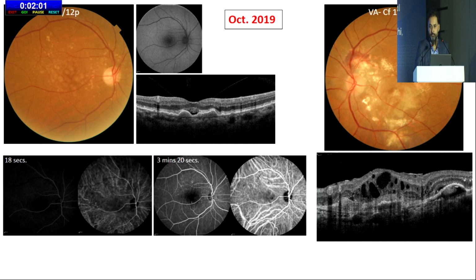We repeated the angio. In the left eye, she started to get some activity in the periphery. We talked about this. She said, I've not been seeing with that eye for some time. I do not want a scotoma limitation. I'm okay with this eye not seeing even as good as it was. She chose to not get treated for the left eye, which was fair enough because the center was already scarred. Right eye, again, no intraretinal fluid, subretinal fluid there, draping over the PEDs. The PED height has gone up. The repeat FA and ICG at 3.5 years shows nothing.